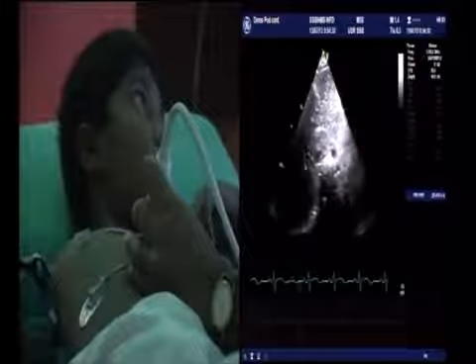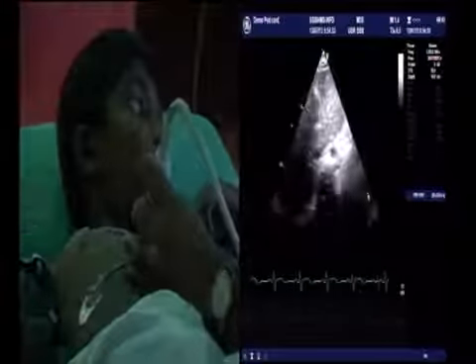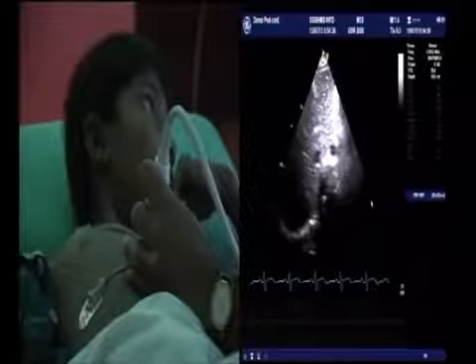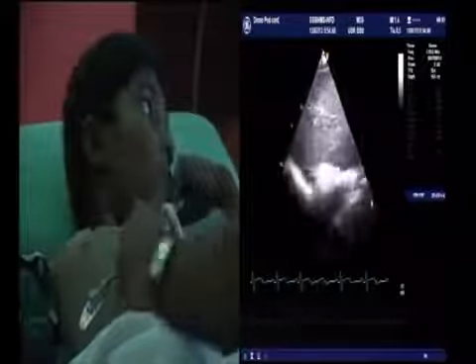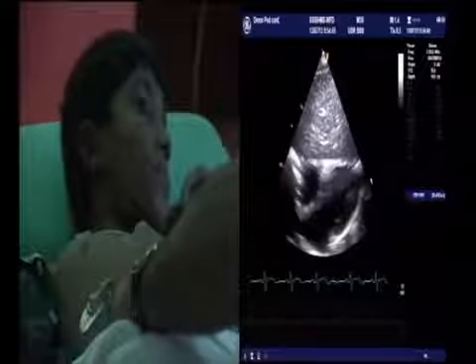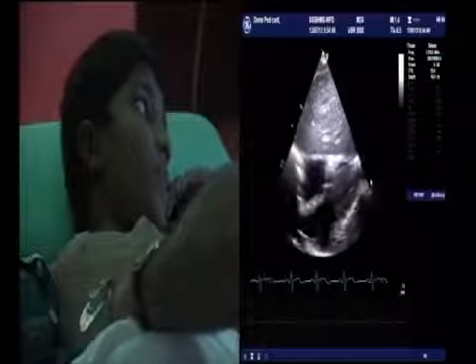This is the liver, as you can see by the echo texture. And this should be the side of the gastric air bubble. So now I know here it is the situs solitus, and as I tilt the transducer up, I clearly see the cardiac apex to the left side. So it is clearly situs solitus levocardia.